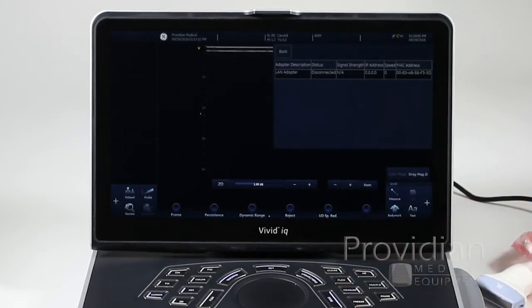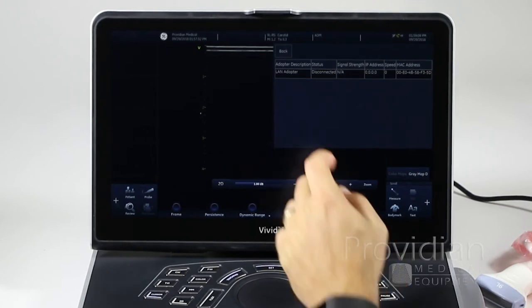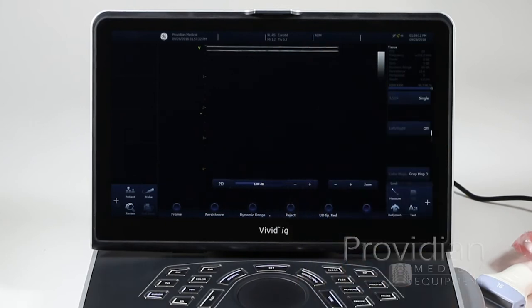Network status will tell you whether you are connected to the network — useful for when you get to the point where you are connected to a DICOM server.